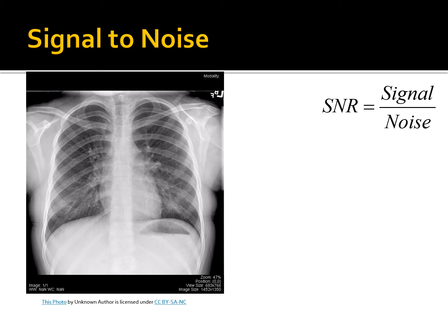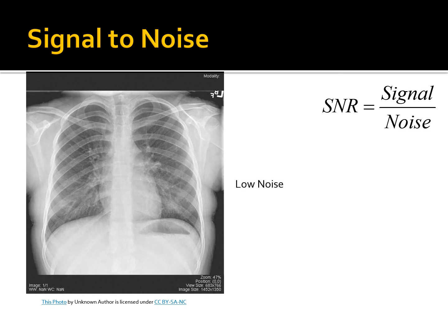Here is a moderately collimated PA chest with a high signal to noise ratio. I've just now added 20% random noise to overlay the image. Notice the changes to the image are subtle. There is noticeable contrast loss. While lung markings are visible, they are not as prominent.